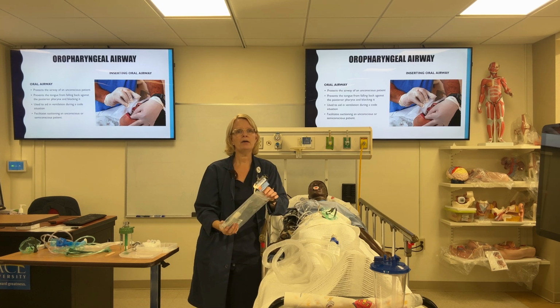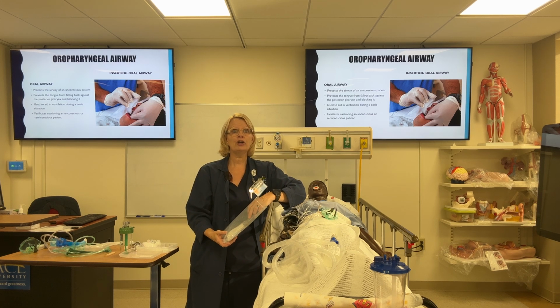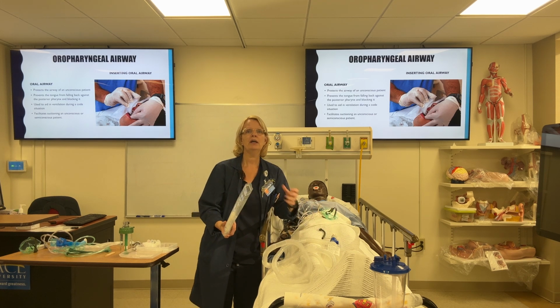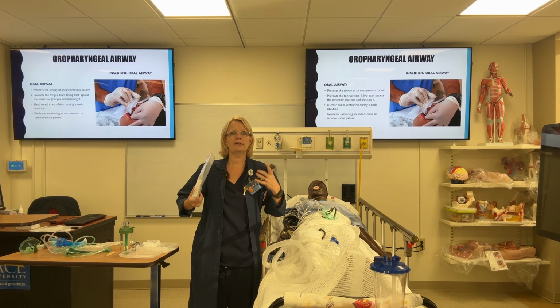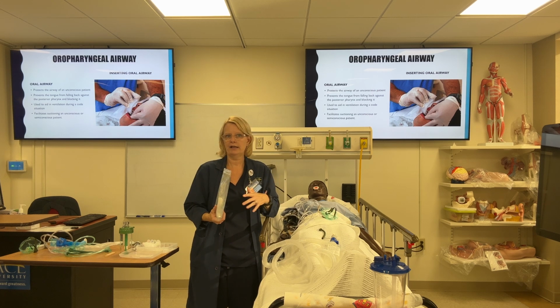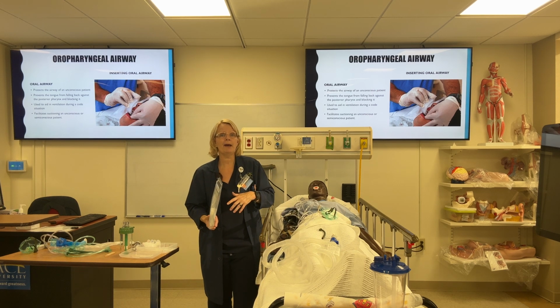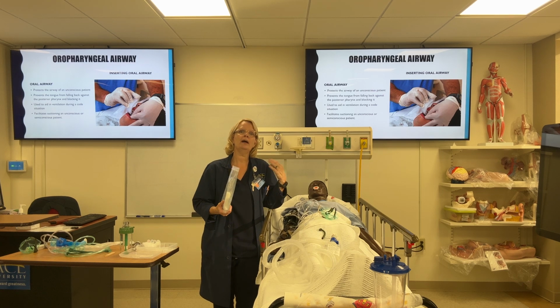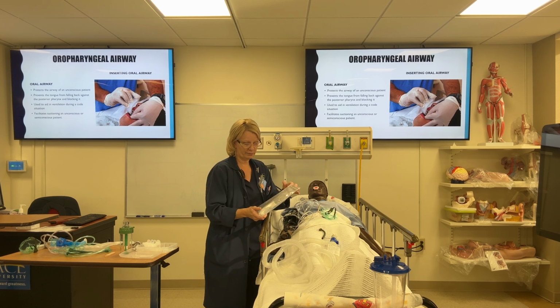And sometimes patients come out of the operating room with a nasal airway. Sometimes they come out with both a nasal and an oral airway, especially if anesthesia is really concerned about the patient's airway. Those are typically your patients with big necks, right? You see these bull necks on these patients. Anesthesia does not like those necks. They are typically the patients who have obstructive sleep apnea, and they're typically the patients who may obstruct postoperatively. So sometimes they come out in advance already with an airway in place, and sometimes two.